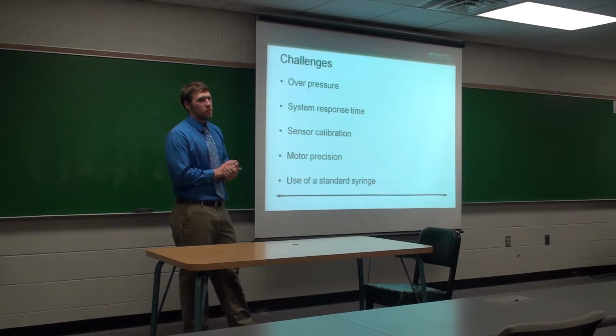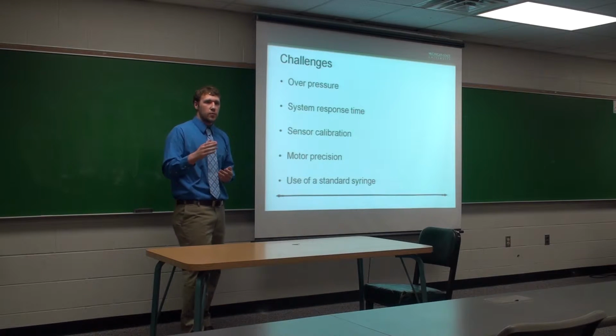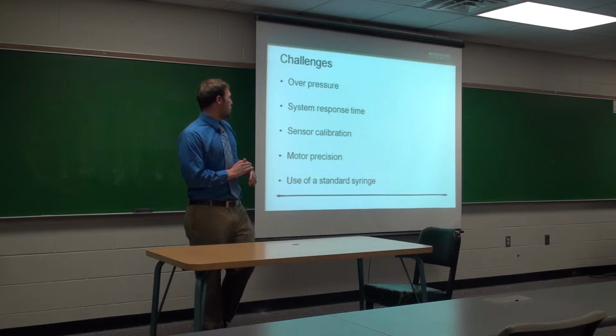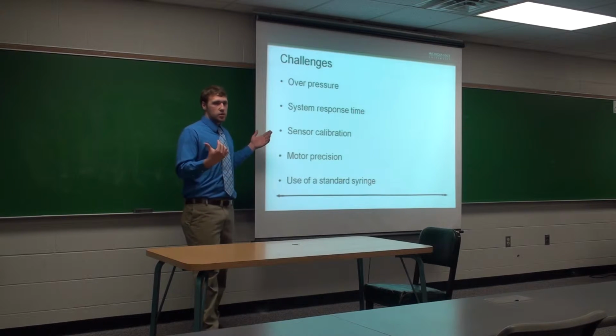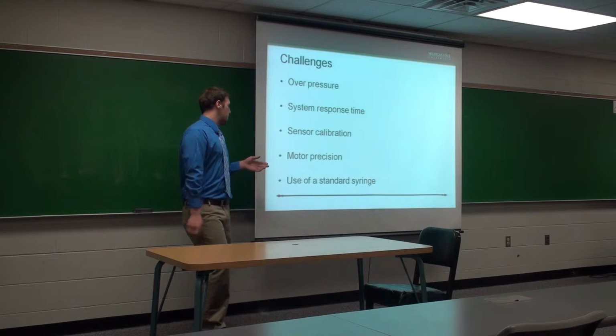But at higher pressures, we have more of a leeway. We have roughly 16 millimeters of mercury to play with, plus or minus 8. So we have more of a leeway at the higher pressures, which will lead to better results there due to our sensor being able to operate at under 2 psi.